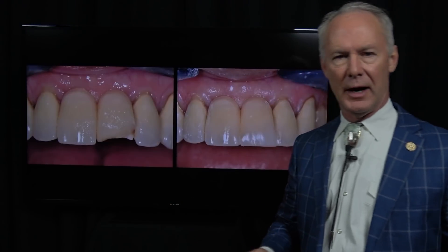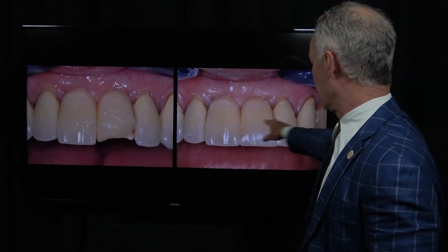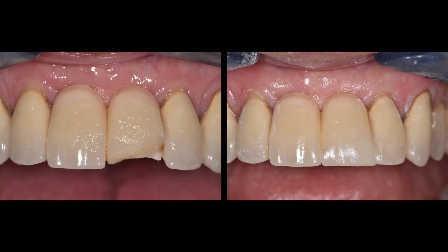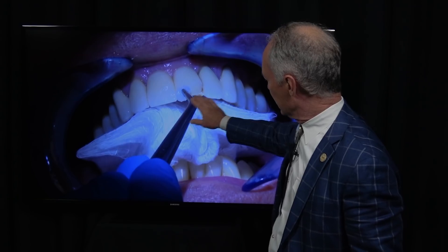Porcelain repair: what do you do when porcelain fractures off of a bridge or a crown? Do you remake the bridge or crown? In a case like this, you've got a four-unit bridge and you hate to do that if you can do something else. So let's talk about this technique.